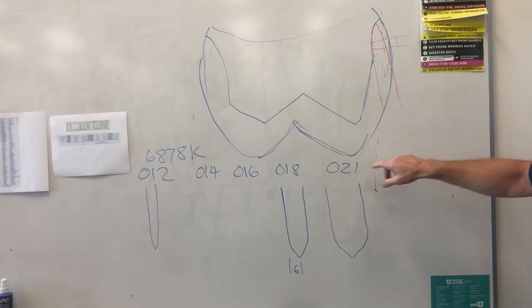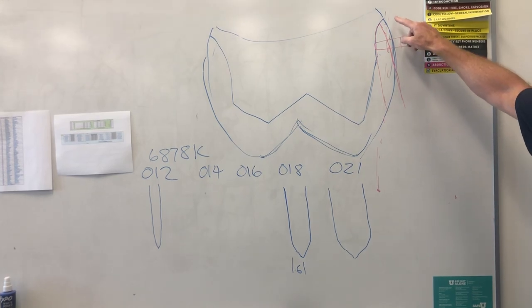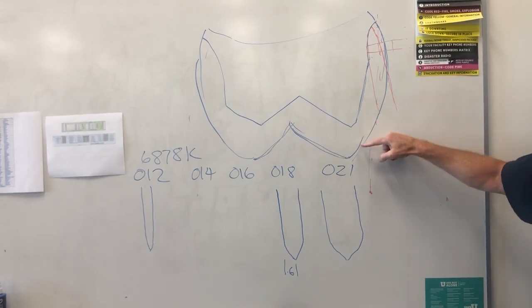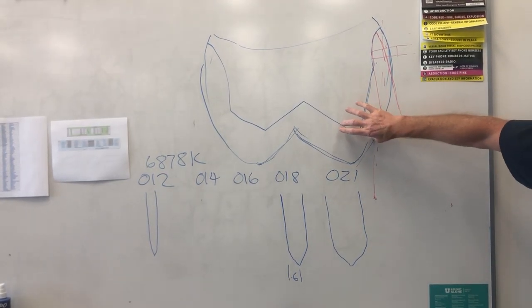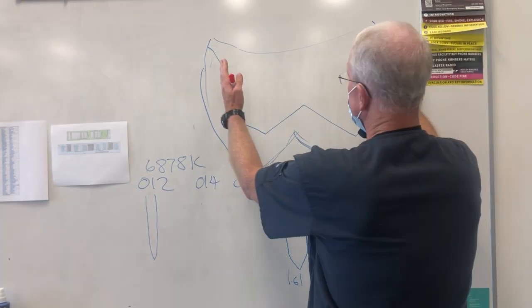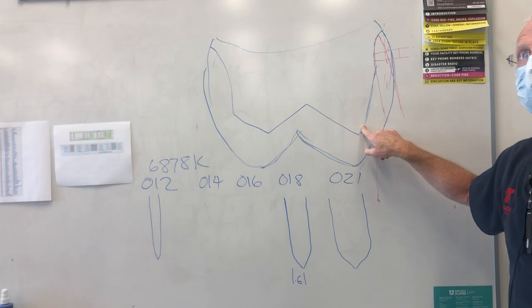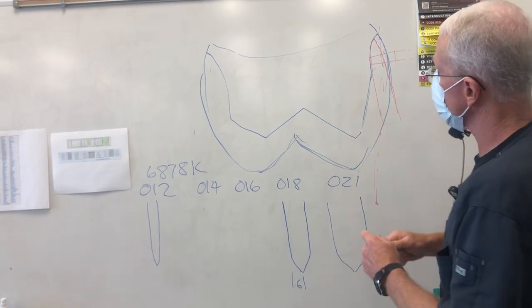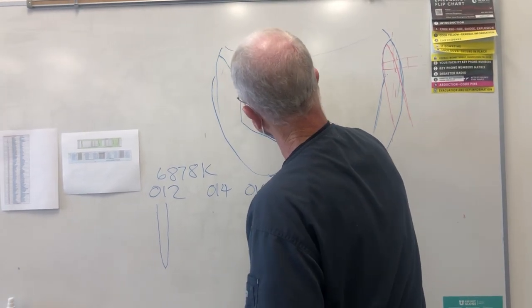On an upper tooth, well, we've got our functional cusp over here. The functional cusp bevel does help us out. But oftentimes, depending upon the axis of the preparation, we have to add a second plane of facial axial reduction in order to get enough space for our restorative material. Now, if the axis of our preparation was more lingualized, more towards the palate, you might not need that. Does that make sense? If the axis of the preparation on this tooth was a little bit more like this, look at that.